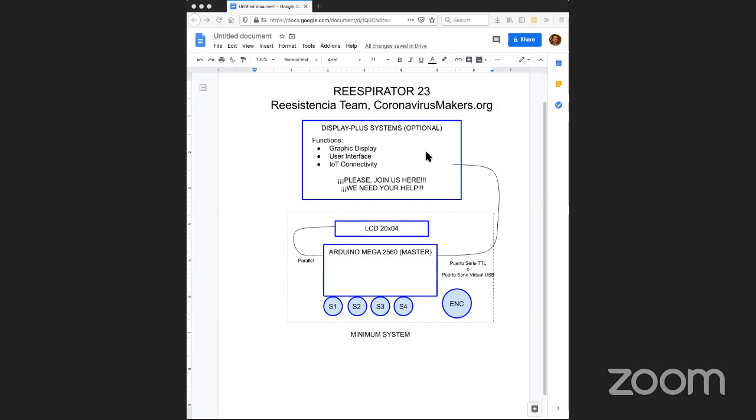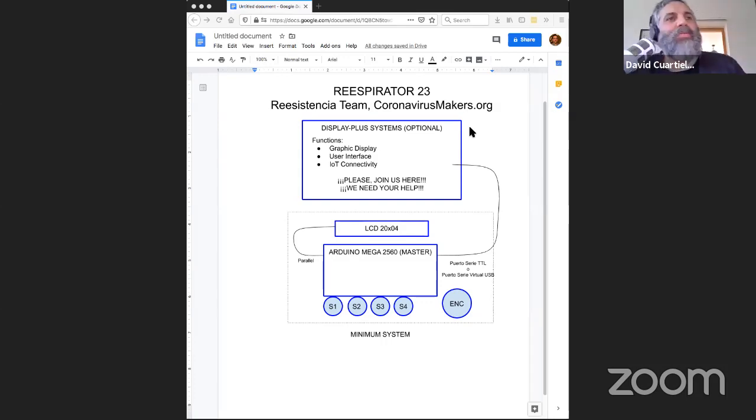Jackson Rees pump. Yeah, I can answer right now that we are using a NEMA 24. The name was because we started with a NEMA 23, but we are using a little bigger motor. It's a direct drive to a lever, in Spanish... it's a lever. A lever with a spiral shape that is very, very beautiful to see. This spiral shape lever moves this mechanism. Okay. But it has to be very strong because, instead of what we thought at the beginning, you need a lot of strength to push the air at the right speed.